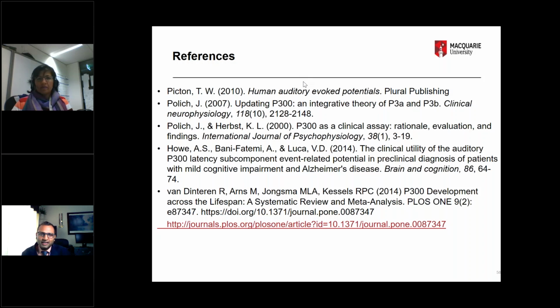And the other thing is, how long does it take for you to do it? Once somebody's done, let's say 5 or 10 normals, how long would you expect somebody to put aside to do the potentials? It is highly dependent on your stimulus duration, of course, and all of that. But I would say, to get reasonable results, not including placing your electrodes, 40 minutes, because you want your deviant to have enough number of averages.